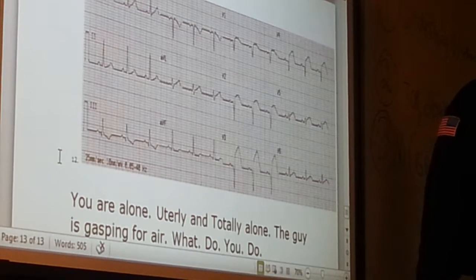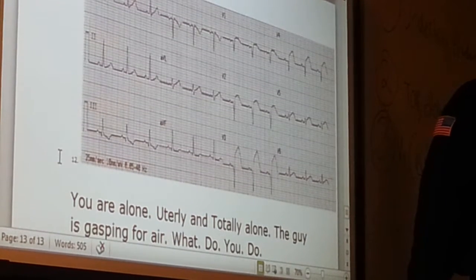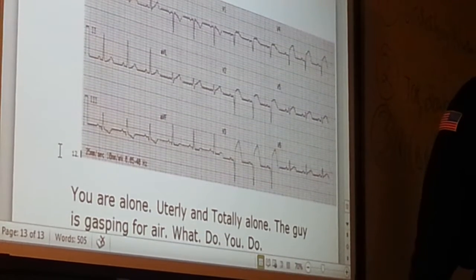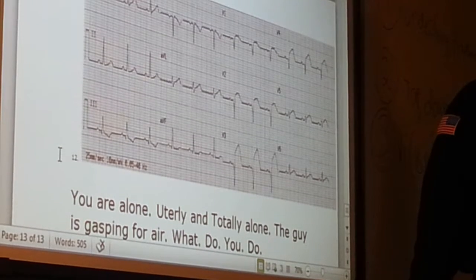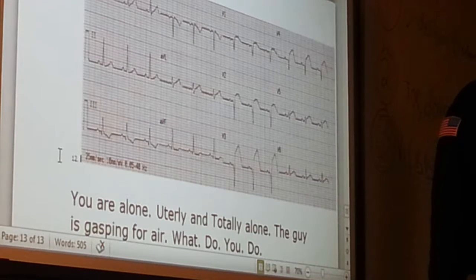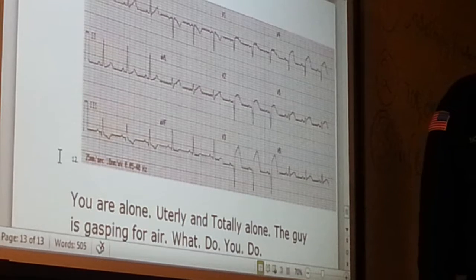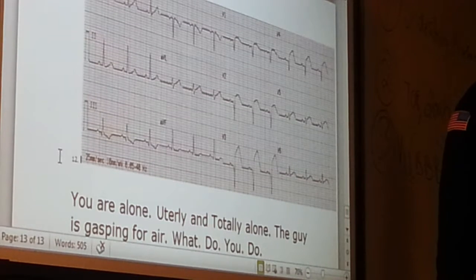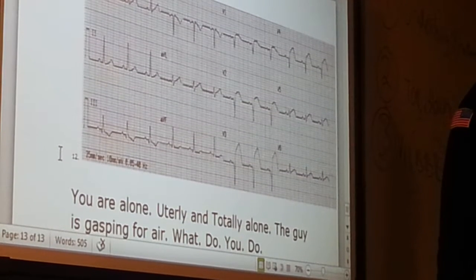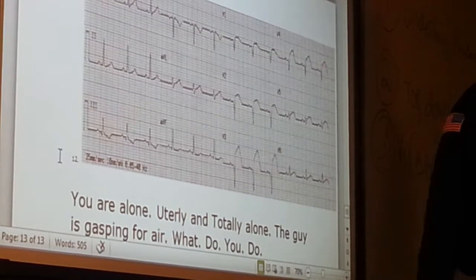Okay. So we have to again continue ruling out our potential issues that would be a mimic. So in V2, that negative amplitude of the QRS complex, plus the positive amplitude of the QRS complex, does that equal 25 boxes or more? No way. Doesn't even look like it. Glancing at it, you know that it doesn't. Okay, so we know that that's not LVH, and we've already ruled out our bundle branch block. So now we know that this guy is having an ST segment elevated MI. Let's keep going through it because now we need to know where this elevated MI is. So keep moving.